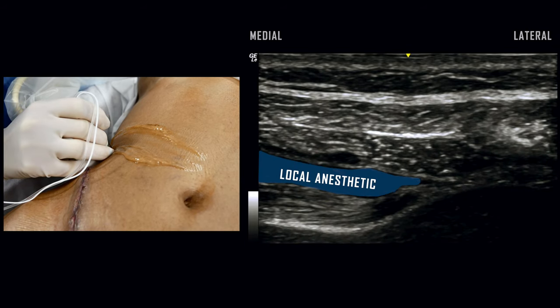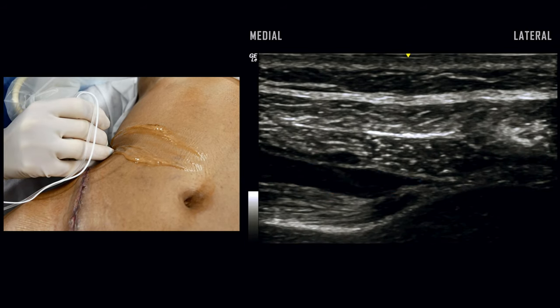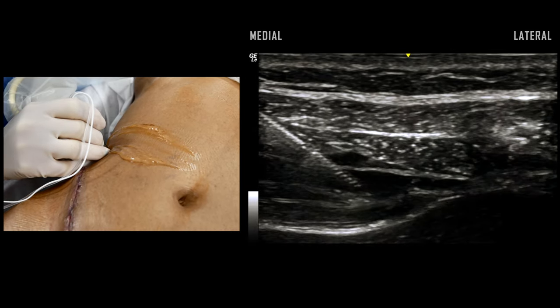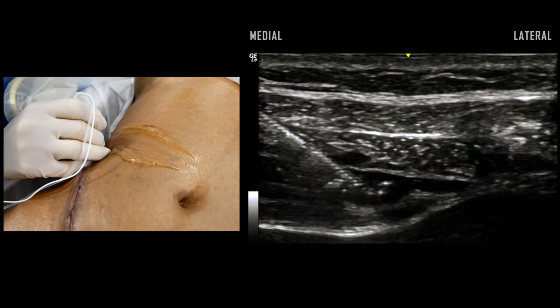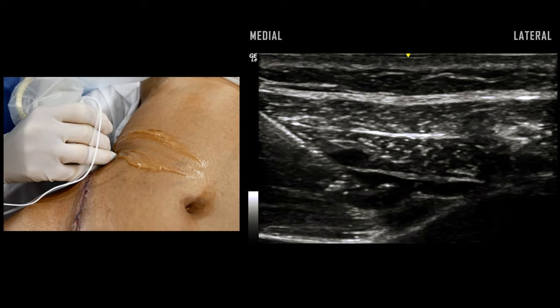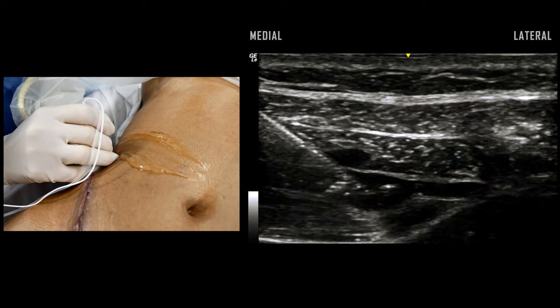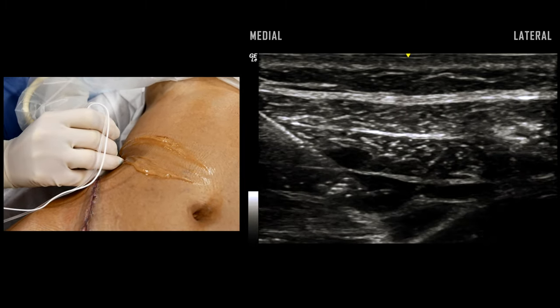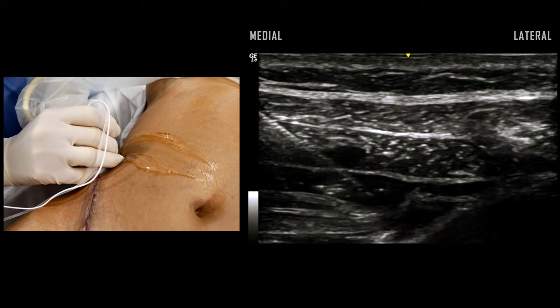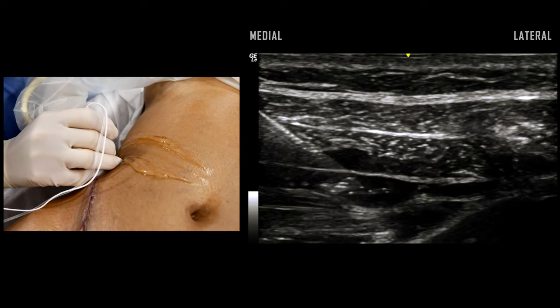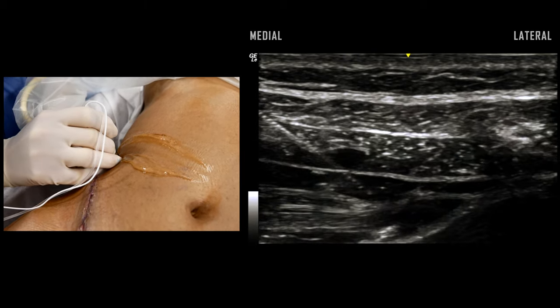Doppler imaging may also be helpful to avoid vasculature in this area. At our institution, we typically use 0.2% ropivacaine or 0.25% bupivacaine with or without epinephrine at approximately one milligram per kilogram dosing for bilateral TAP blocks.